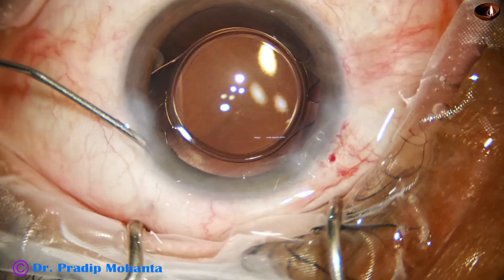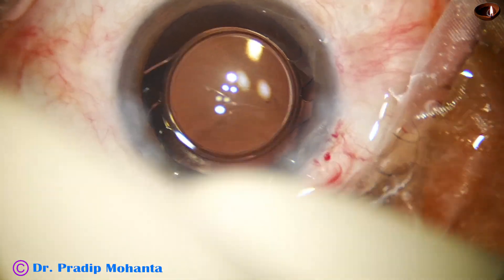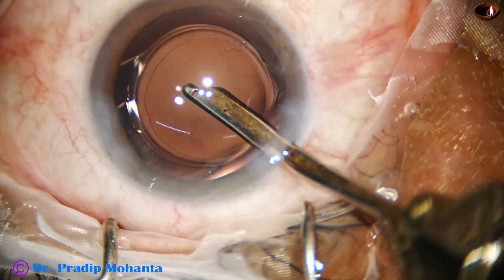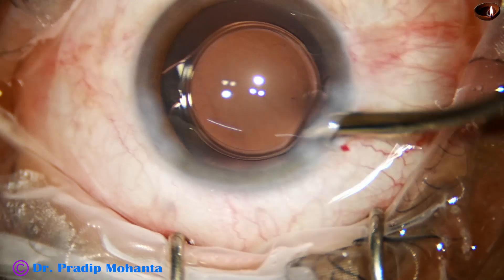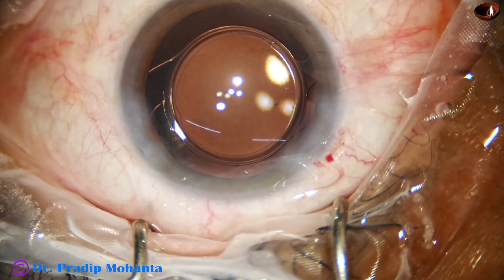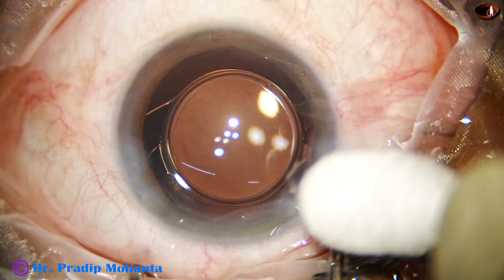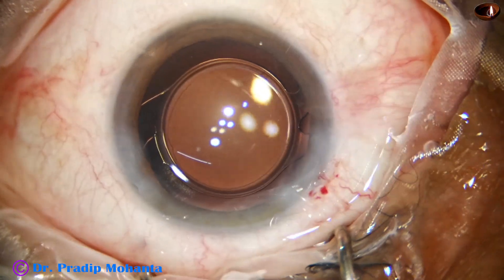But if there is a multi-piece lens, we must be very cautious — we should use viscoelastic substance with multi-piece lenses such as Sensar multi-piece or Auro multi-piece lenses. Now we are towards the end of the surgery; the integrity of the wounds is checked and the case is concluded.